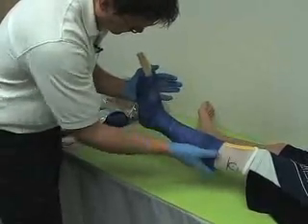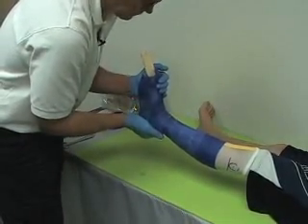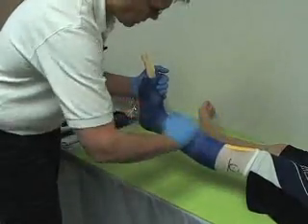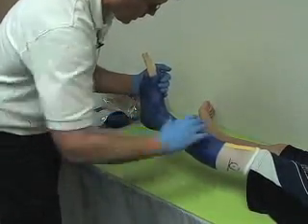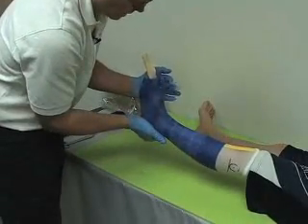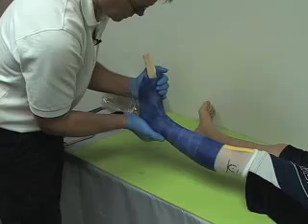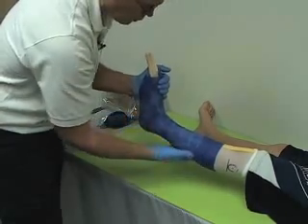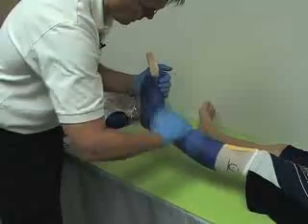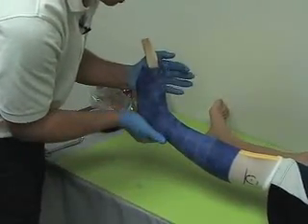As you are rubbing it in, slowly start finding R1, feeling your heel, supinating the forefoot as required, and bringing him up. One of the things to note is if you have a patient that drops substantially during this process: once you get that position, adduct the forefoot slightly to create a more rigid, bony alignment lock. This prevents him from collapsing and requires less force of the brace to hold him there.